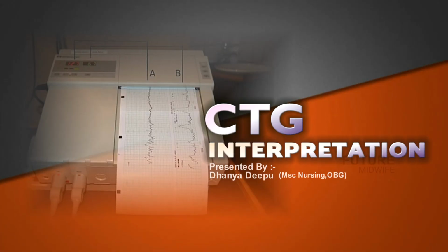Here we can wind up today's session. This is about the detailed interpretation of CTG information.